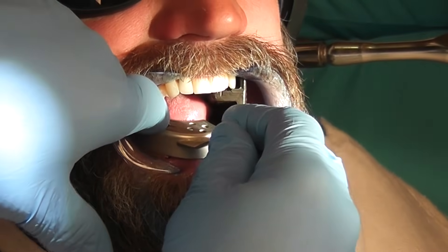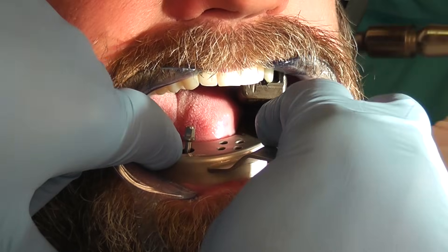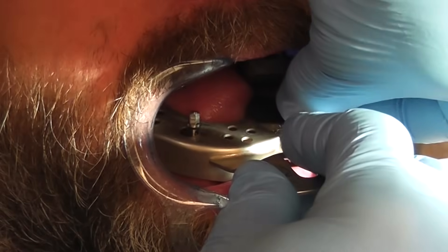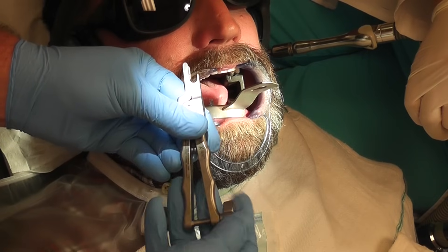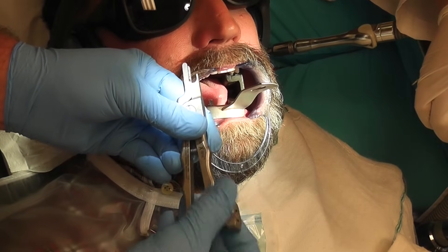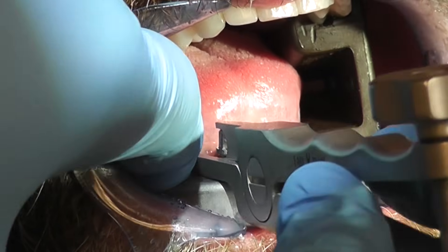Here I'm trying the tray on to the screw. You want the tray to seat on the screw until the slash in the side of the screw becomes visible, and that means it's seated far enough so the jaws of the Easy Extractor can fit completely around the head of the screw.